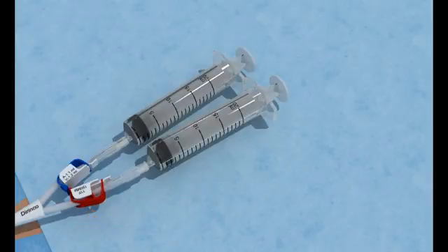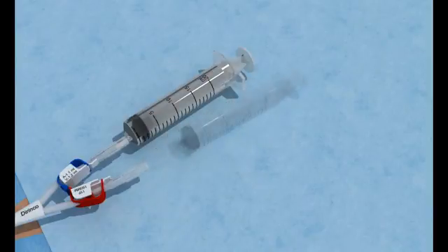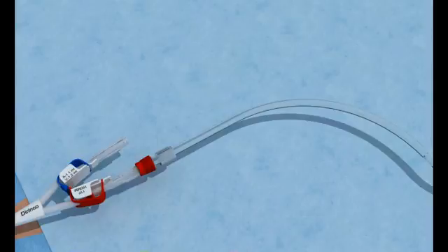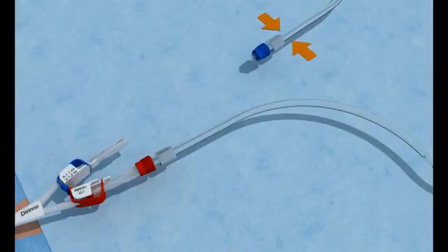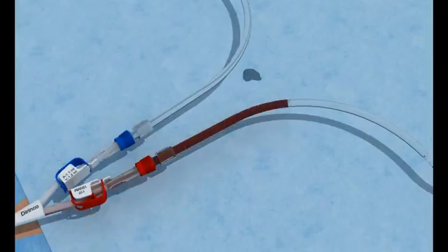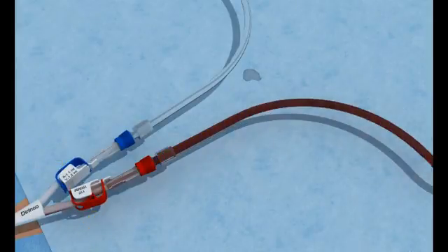Leave the syringes in place to block the ports. Connect the blood lines. Connect the arterial blood line to the arterial lumen. Remove the empty 20ml syringe. Connect the venous line. Open the clamps and start the dialysis. Restore the patient to an upright position.